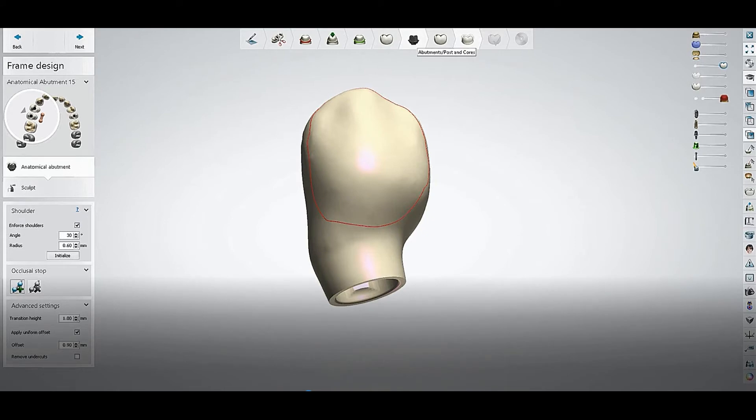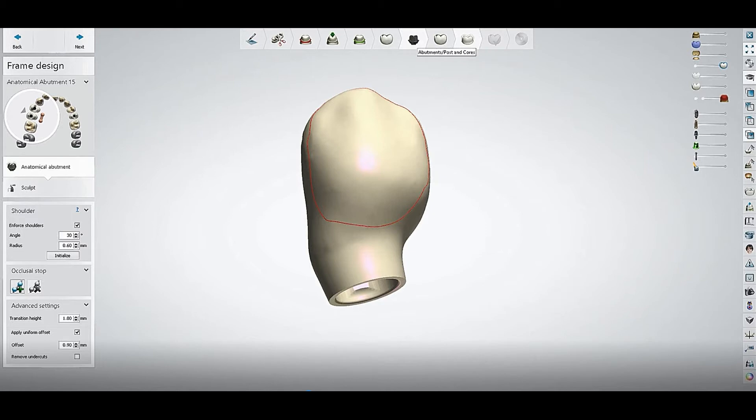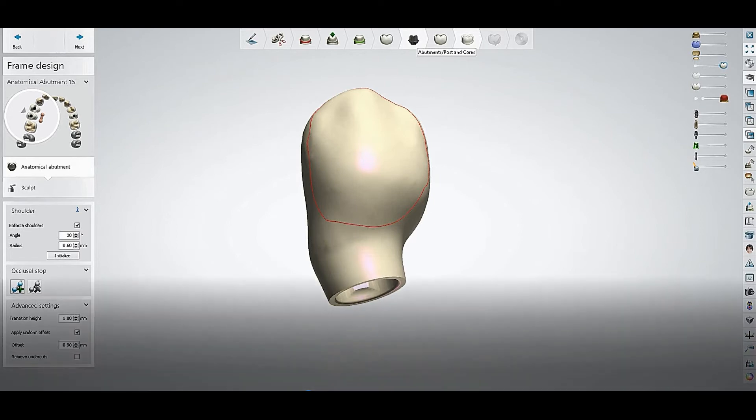Now we will go back directly to the option that is related to the implants, where we make the profiles or the angles for the implants. That's the abutment or post and core. We'll directly go there to solve this issue.